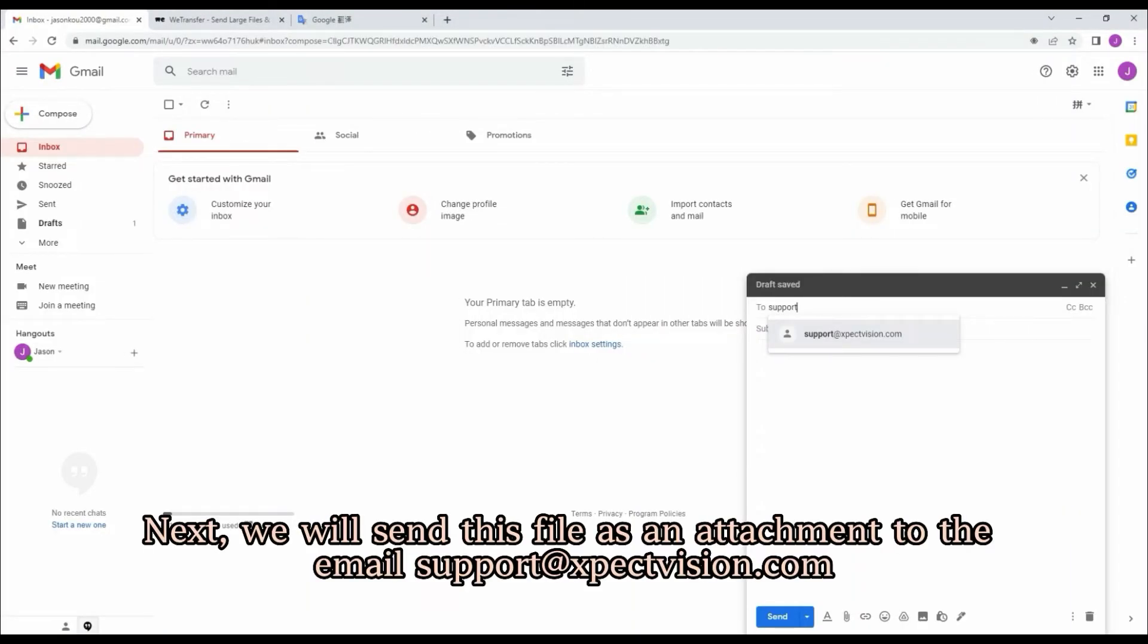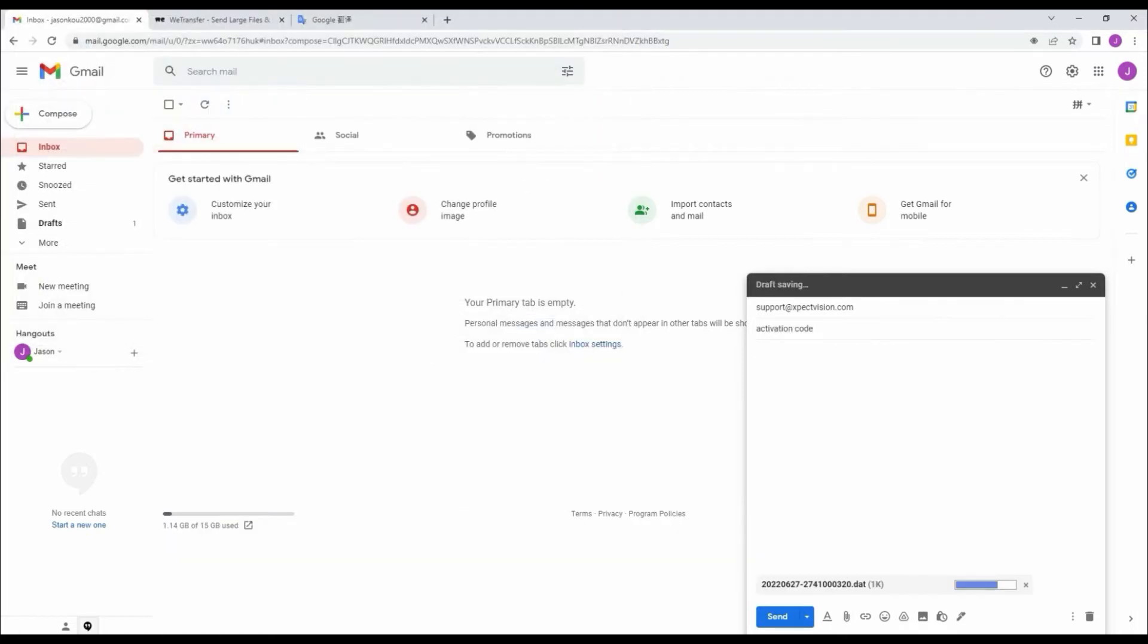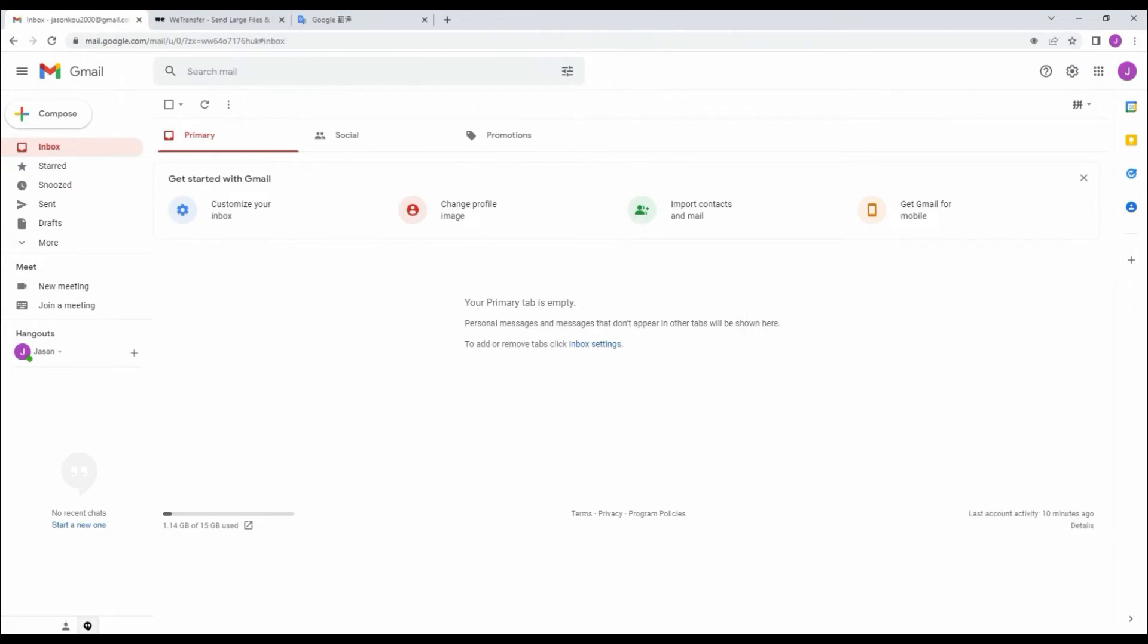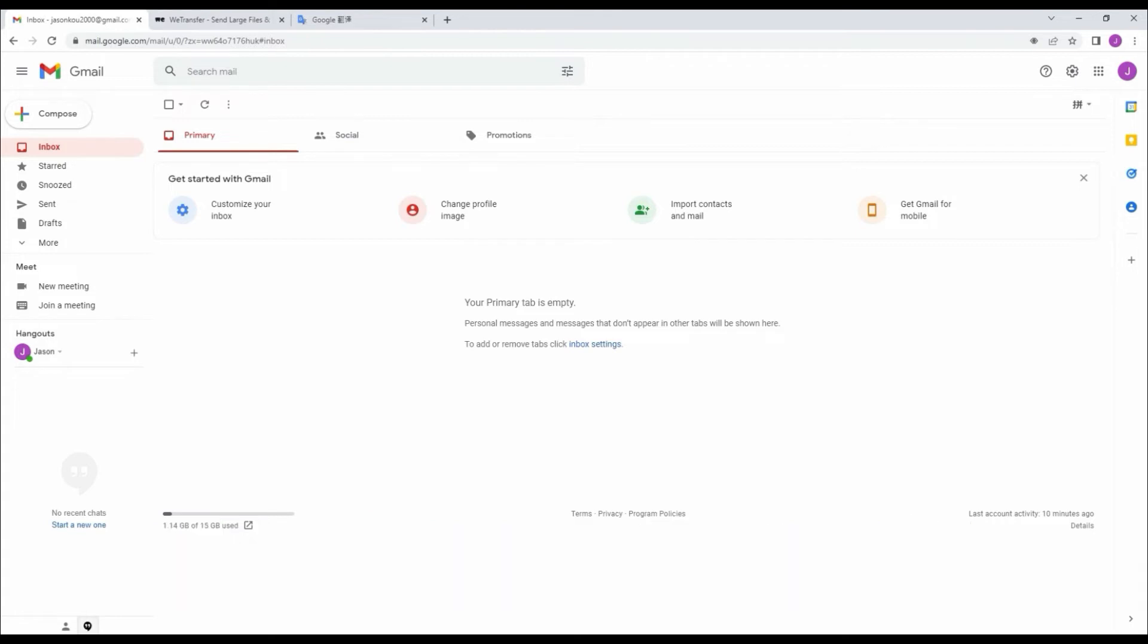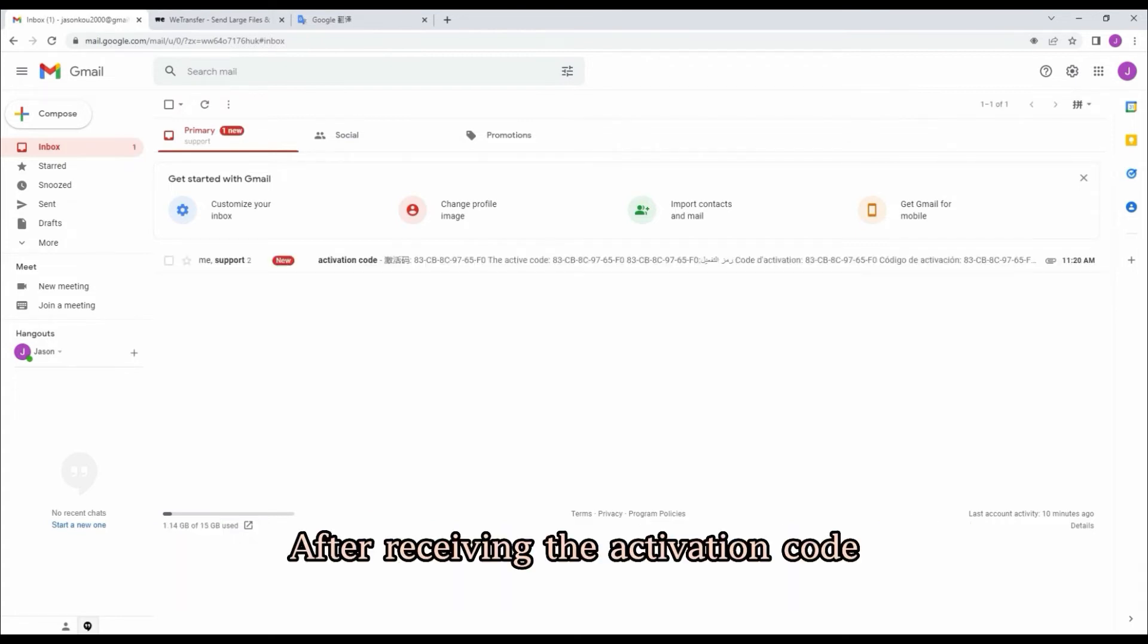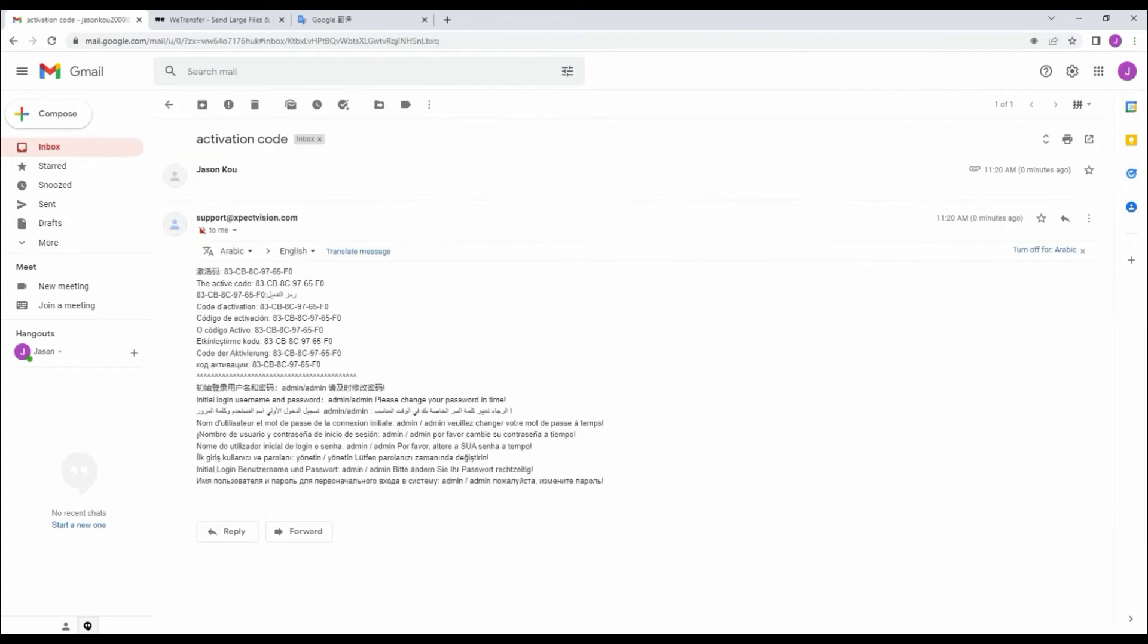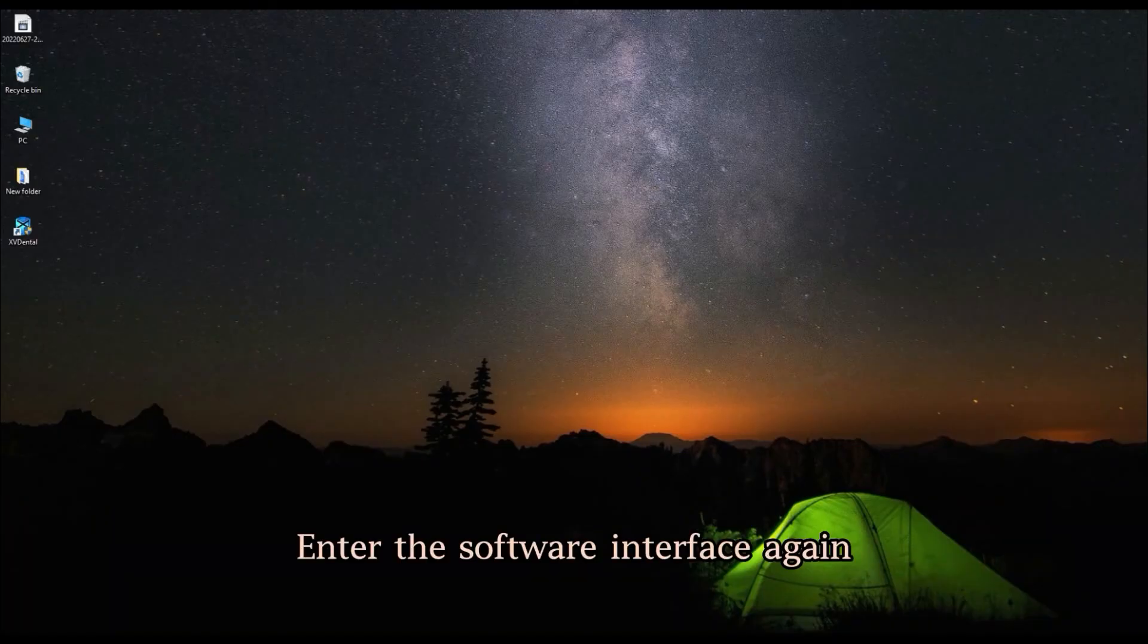Next, send this file as an attachment to the email support@xpectvision.com. Usually, you will receive the activation code within 24 hours. After receiving the activation code, copy it.